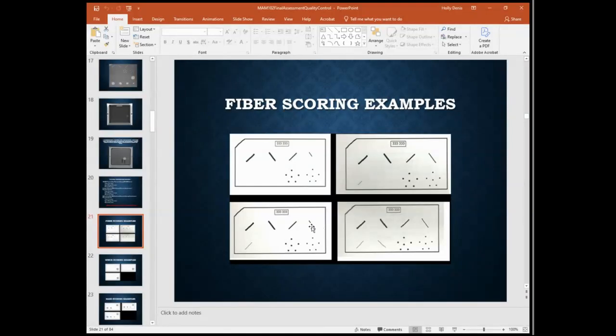So now that we've counted that as a half, I cannot come down here and count this one at all, because remember, we have to stop. If we don't get a full point, we just stop counting completely. So even though I see a full one here, this is not 1, 2, 3, 4.5. It's 1, 2, 3.5, and we stop. So this is just nothing. Okay. Good on that?